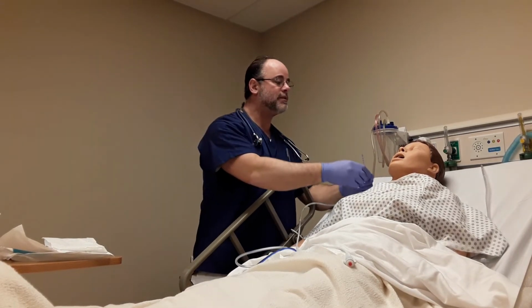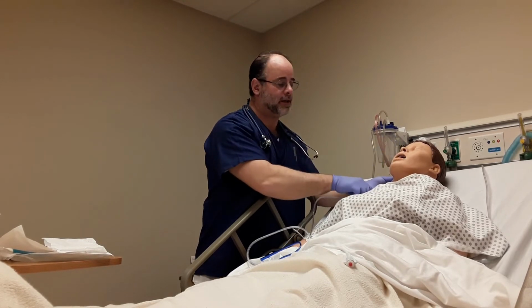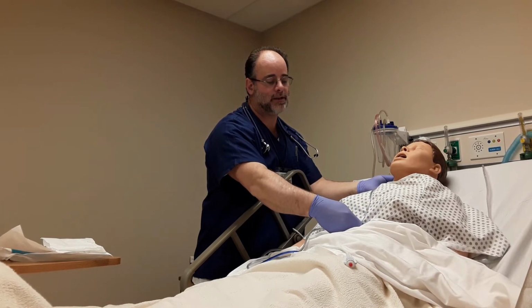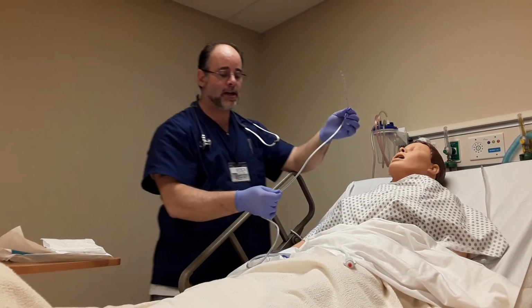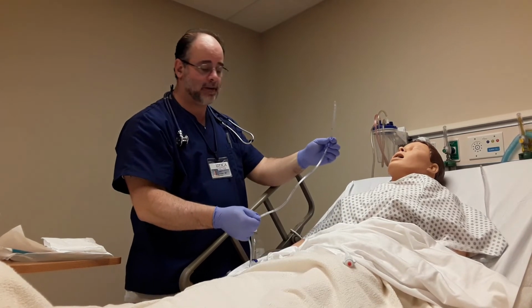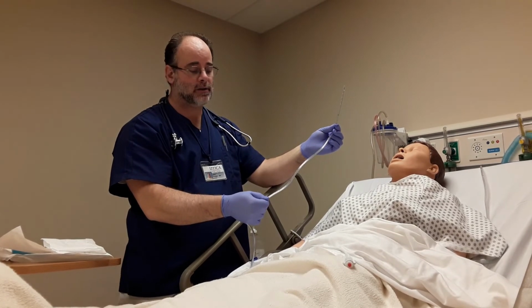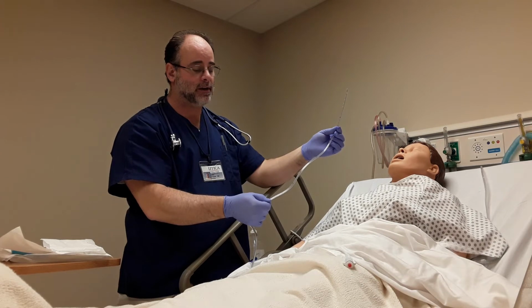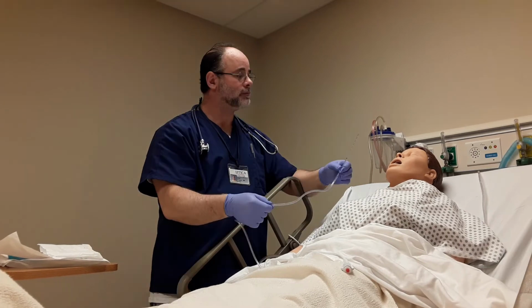Okay, so for measurement, sir, I'm going to take this from the tip of your nose to your earlobe, and then I will bring it down to the xiphoid process, and then I'm going to go about another inch or so just to make sure that we get past that gastric sphincter. Okay, and for documentation purposes, it's at a 55. Some tubing does not have any marking as such, so it's customary putting a piece of tape there and/or making a mark with a marker to the area. But I know from my documentation that I can say it's a 16 French Salem sump.